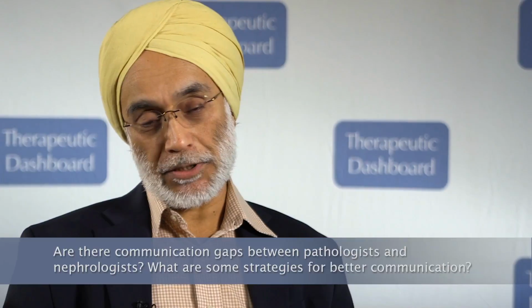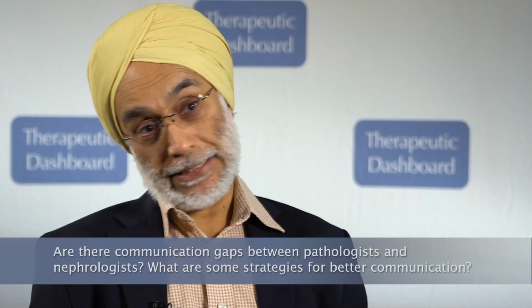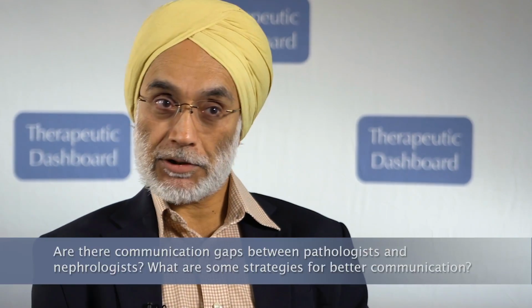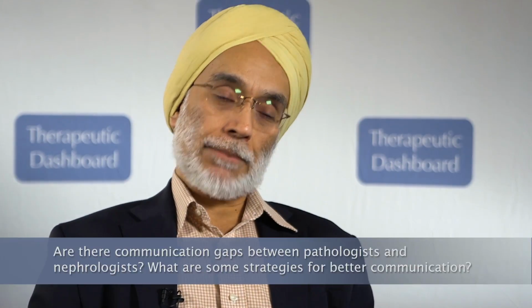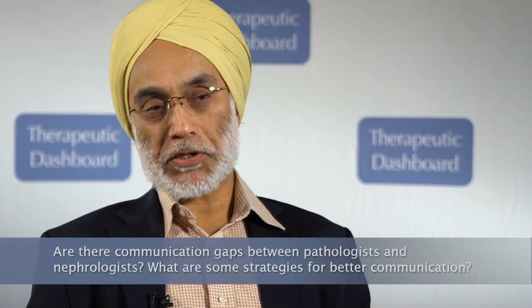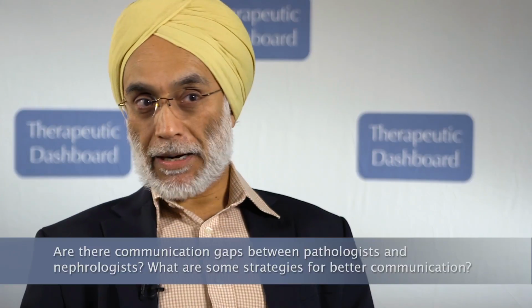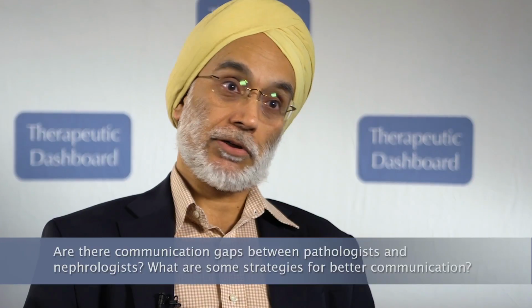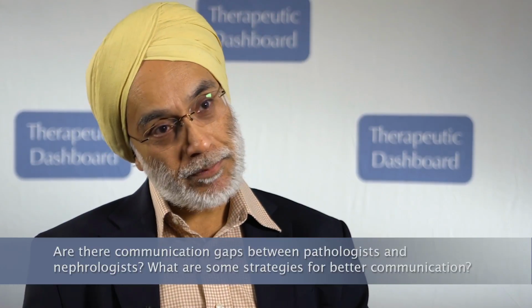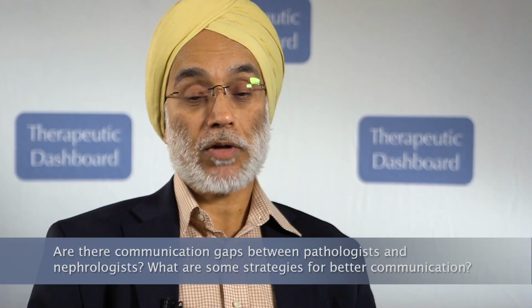So for example, even biopsies which are called borderline, some biopsies may have only 11% of the biopsy inflamed. Others may have 24%. As long as it's less than 25%, it's called borderline. And also the percentage involvement of inflammation in a biopsy doesn't tell you how dense the inflammation is. The inflammation could be really sparse and yet occupying 25% of the biopsy, or the inflammation could be really dense, the kind of the blue kidney, which I was mentioning yesterday, and that again is borderline. So it's very important for the nephrologist to come and see what it is that he is talking about.